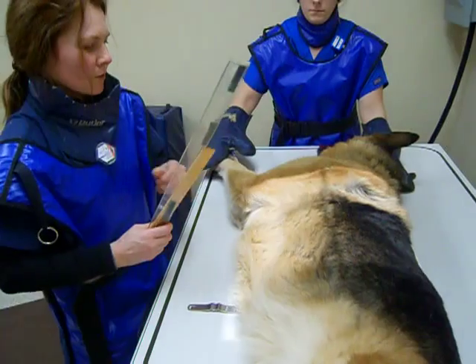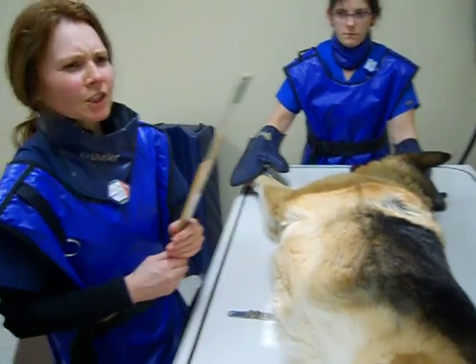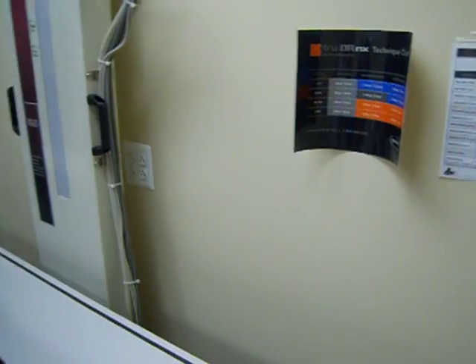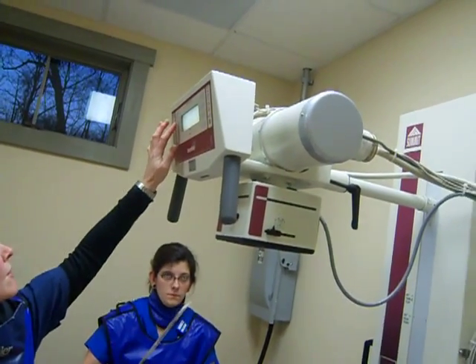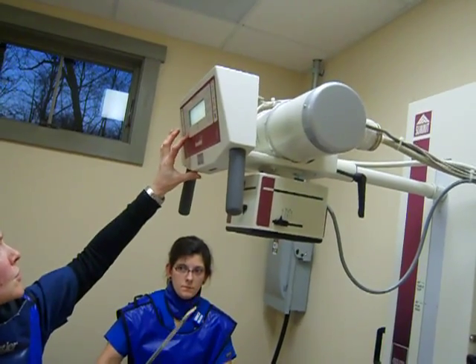So I would go to my technique chart, look up my kVp and my mAs, and I would select the exposure factors for this projection.